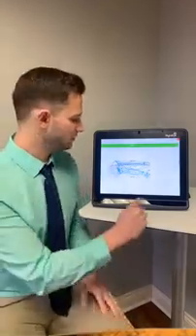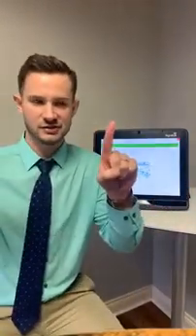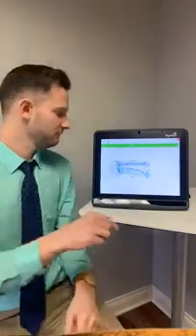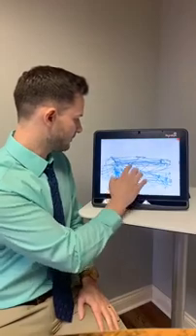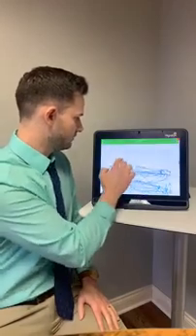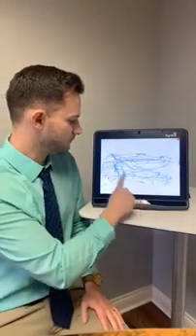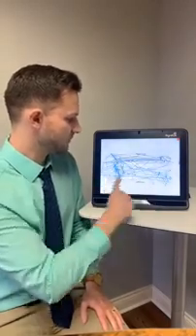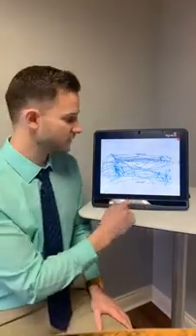So here there's two dots on the screen just where my fingers are and we're seeing how the patient jumps their eyes back and forth between the two targets. I'll zoom in a bit so we can see it a little better. And now the patient is supposed to be jumping back and forth over the same line, same path every time. We can see that it's not the same path every time.